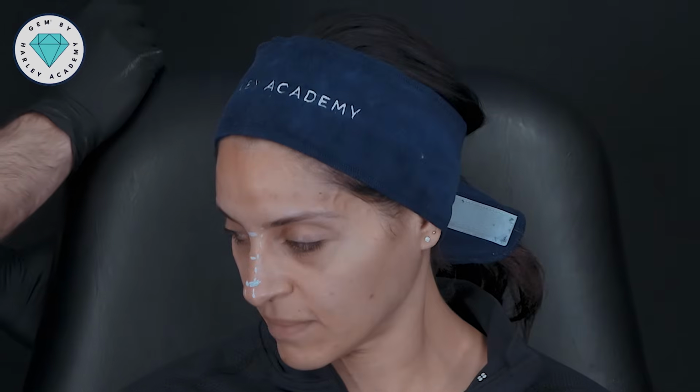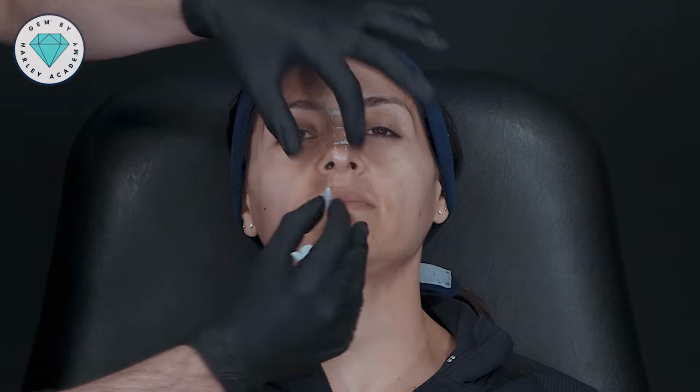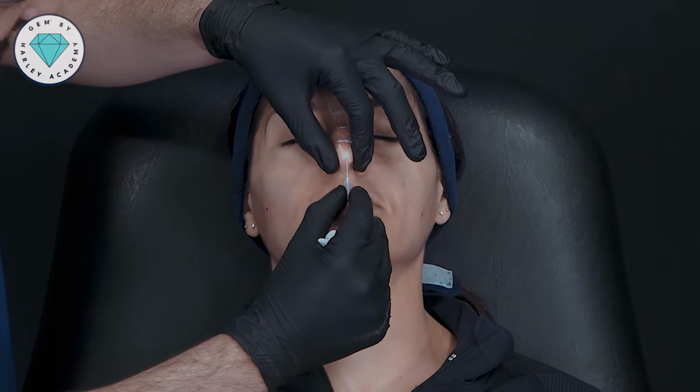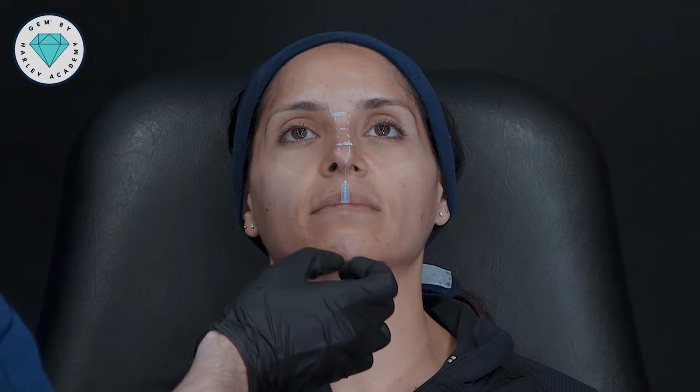So let's go back. I want to now move to a 25 gauge cannula, just making an entry point just beneath the tip of the nose like this. And again, I always leave that a few seconds just to ensure that there's no cannulation of the vessel.